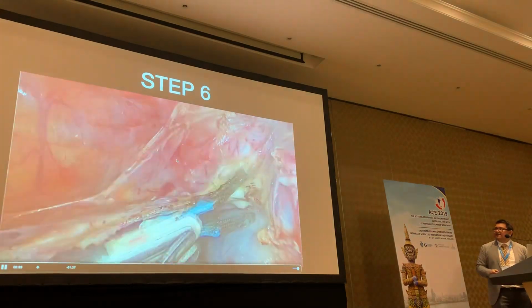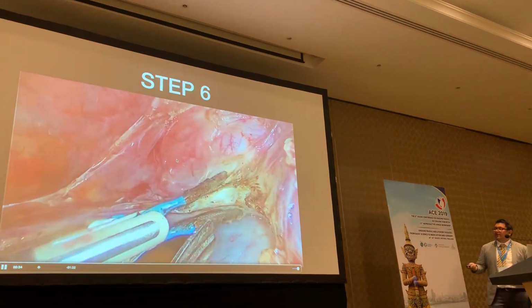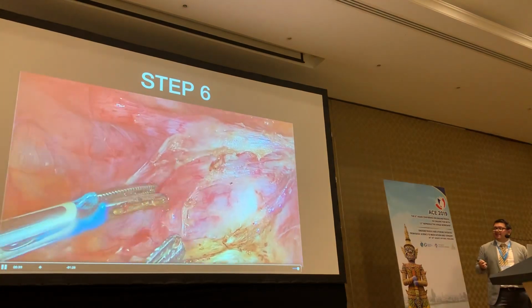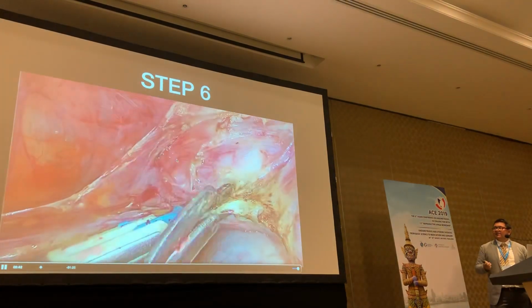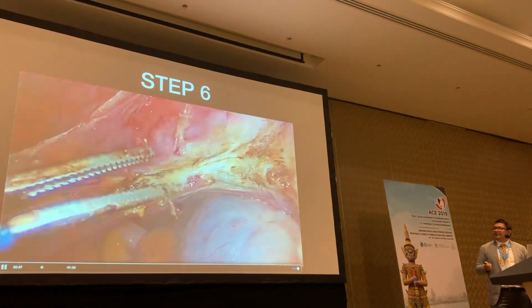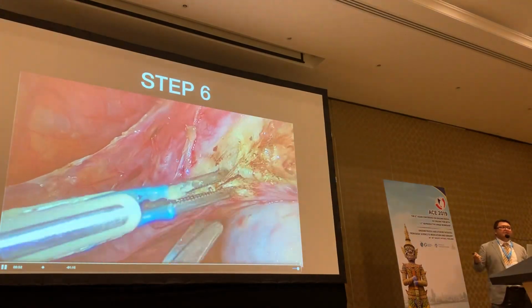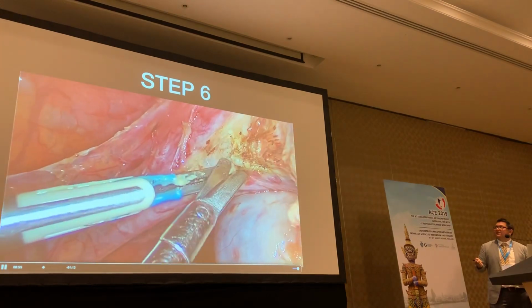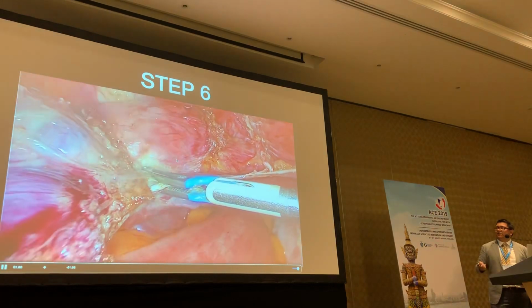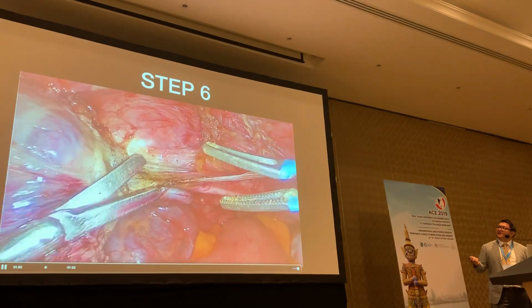So you might have to deal with it along several planes, and beware of the veins. We all tend to pay a lot of attention to the artery, but we will push in and nick the vein quite often. So that's something to watch out for. You usually don't want to allow the venous bleed here because the vein will retract, and when you chase it down is usually when the ureter gets injured. So you've got to watch out for that. As you can see on the other side, the co-surgeon takes it and the incision is made.